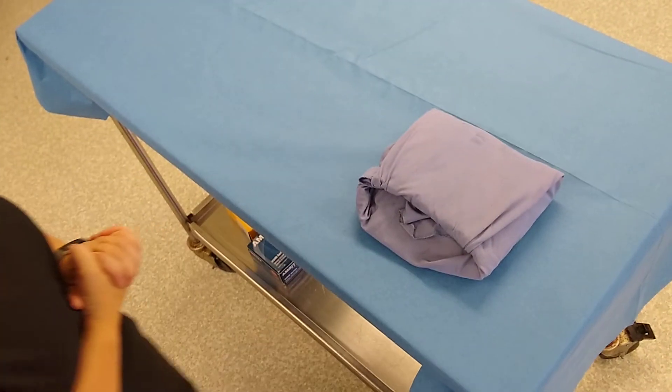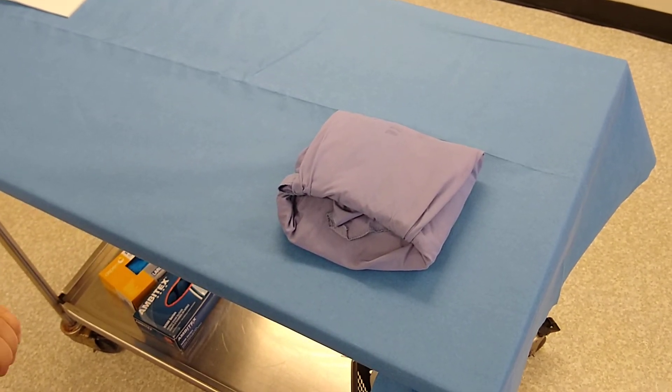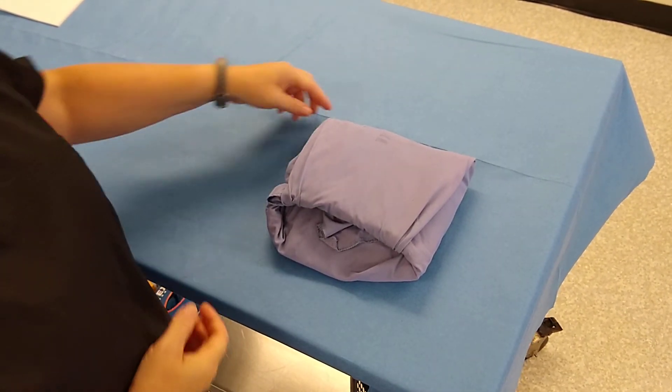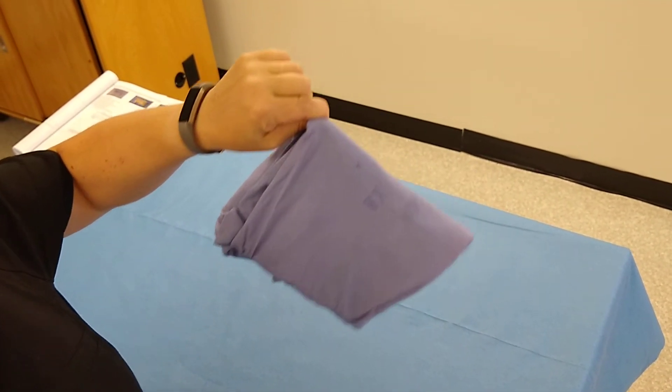Now, some people say to check if your pack is wrapped tight enough you throw it against the wall — that's really a no-no because you'll break your instruments. But if you really want to check it, pick it up by one of the corners and shake it. If it doesn't come undone, you have it wrapped tight enough.